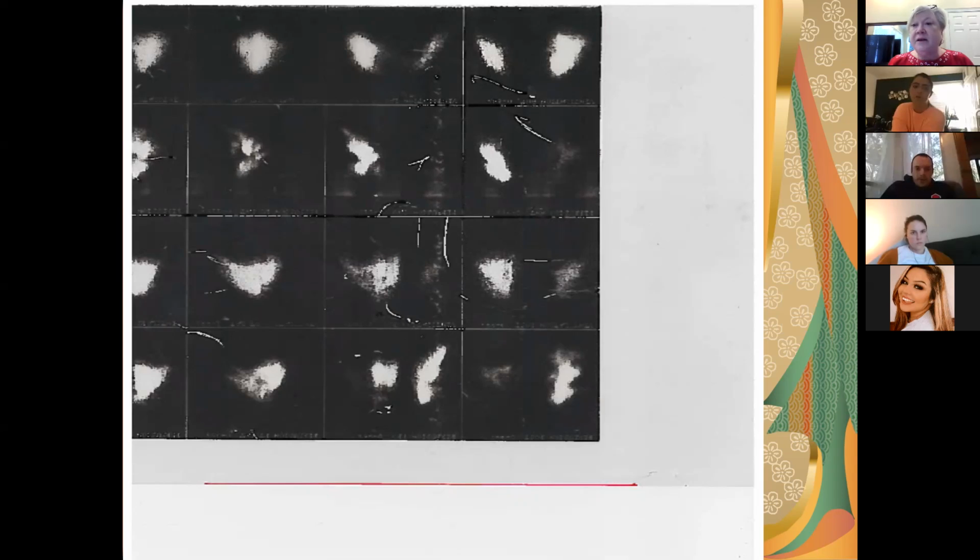Ventilation, perfusion scan. Do what? Sorry, I don't think we could see your mouse, like where you're circling, if you were. You are correct. Sorry. You are correct. Just a second. These here are not it. These here are laterals where they only see one lung because they're only looking from the side. Okay, so it's not these. That's why I have it off to the side. It's these. So this should show two equal lungs. It should show blood flow that's equal. And as you can see, they are not equal.